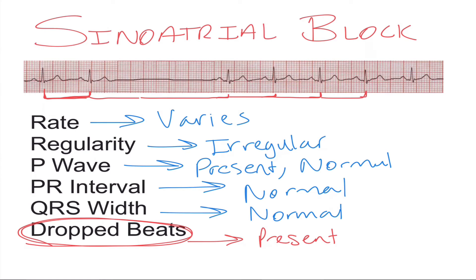That's one of the major characteristics of a sinoatrial block: you'll have a rate that varies with an irregular rhythm, everything else looks normal, but then you have these dropped beats between each QRS. If you've got all those things present, there's a pretty good chance you're looking at a sinoatrial block.